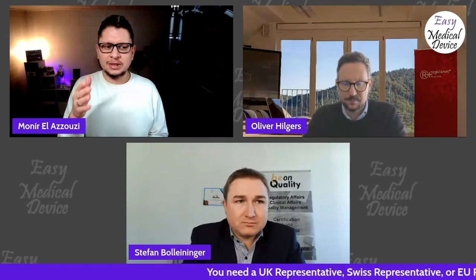Okay, so a really interesting discussion, because what does it mean? It means that at a certain point of your chronological pathway, there is a point where there will be a decision that should be made. Any software that is used before to go through this decision and maybe taken by a professional is then maybe going through this first sentence, so then it's going to be maybe class 2A.